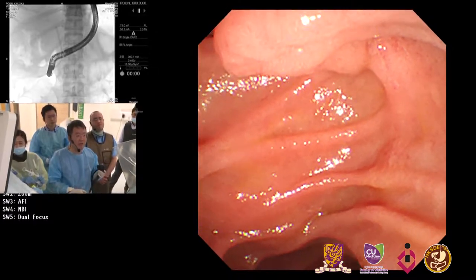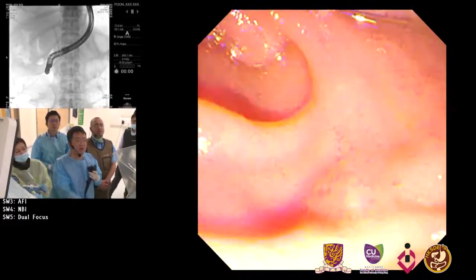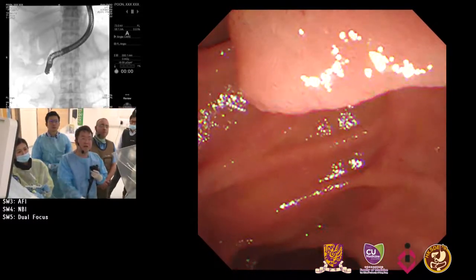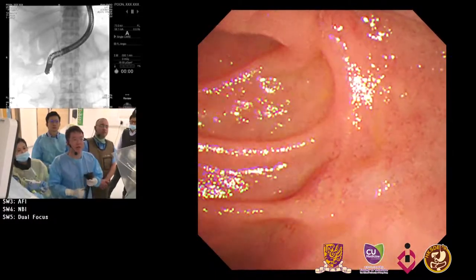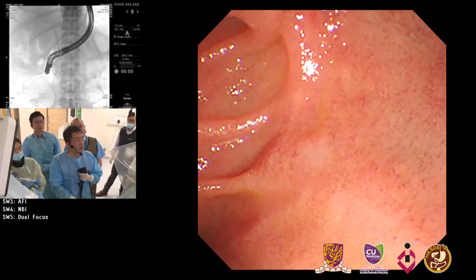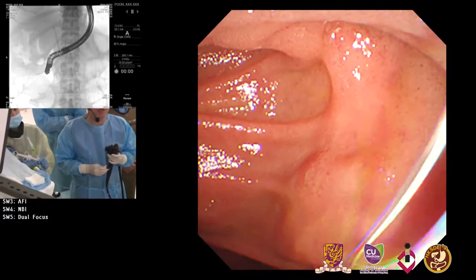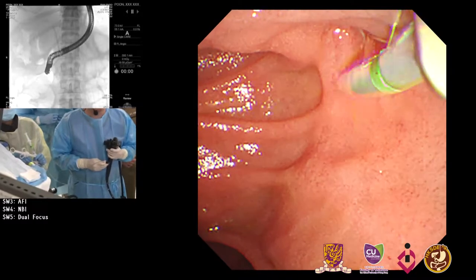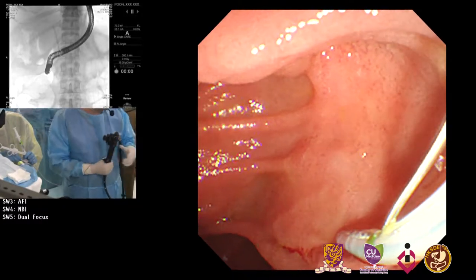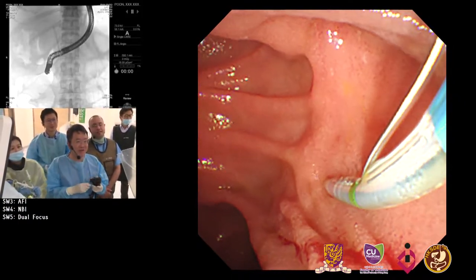So when I entered the duodenum, there was some stenosis. However, I got into the second portion, and we found the papilla has poor axis and is very downward. The previous biliary stent, we think, maybe migrated internally. So my plan is to cannulate the ampulla, because previously there must be some papilla orifice that has been opened. If not successful, I will use a needle knife. And if not successful, we have a rescuer, Khashab. He will help me from another route, EUS guided.